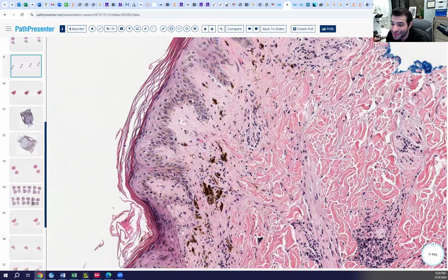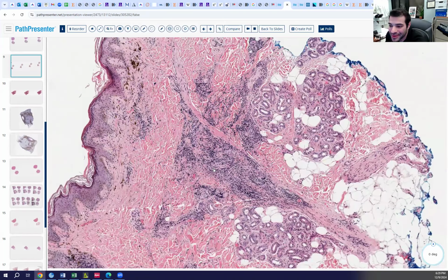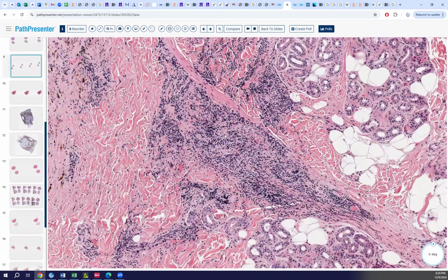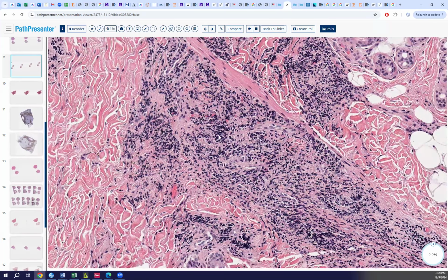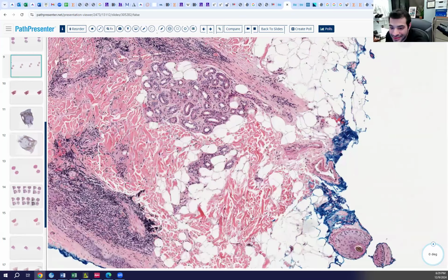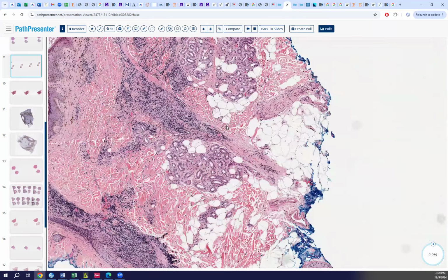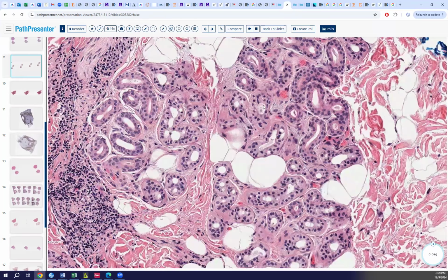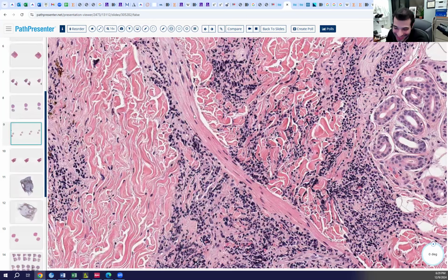Then yeah, I guess you do a DIF, but actually I don't even know if that'll help at that point. You still have the mucin. In DLE you might get infiltrate around the eccrine glands, whereas you're not going to get that with LPP with the epidermal involvement. And this is the worst case because these eccrine glands look good. So you're left looking for mucin. Oh man, that's horrible. I never want to get a case like that.